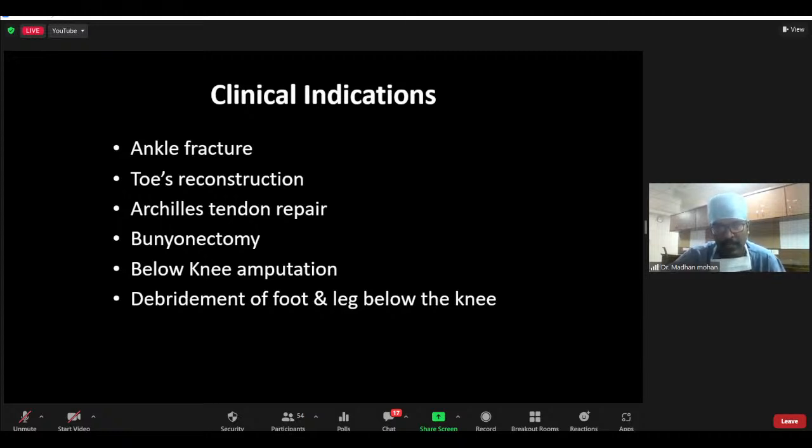Since a popliteal sciatic nerve block is a very superficial distal peripheral nerve block, even if the patient is on anticoagulant, it is not going to present a problem. We have been routinely doing a lot of cases, even with anticoagulation, where we give the popliteal sciatic nerve block.